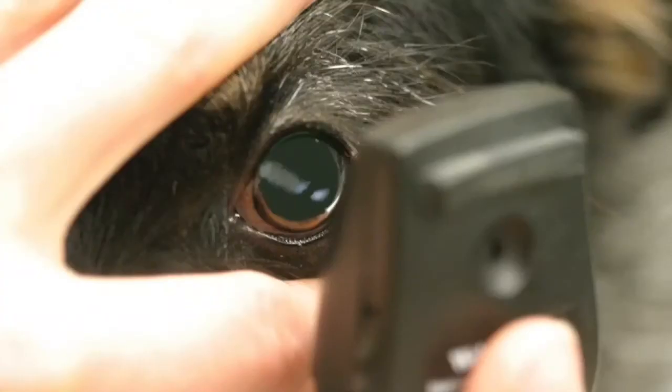In a normal animal, one should note a reflection off the cornea, a dark space behind the corneal reflection, which is the anterior chamber, and then a beam of light traveling through the lens from the anterior to posterior lens capsule. The anterior chamber contains aqueous humor and is normally visualized as a transparent black space between the posterior cornea and the iris or lens.